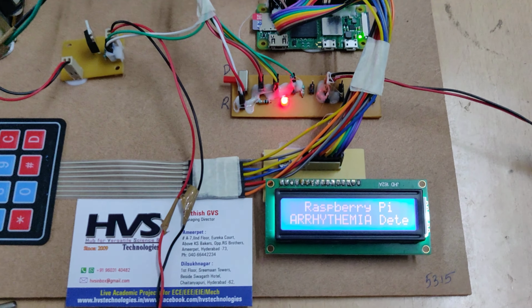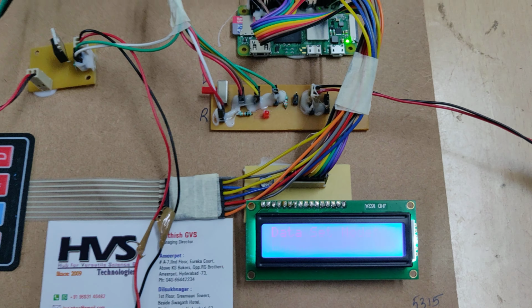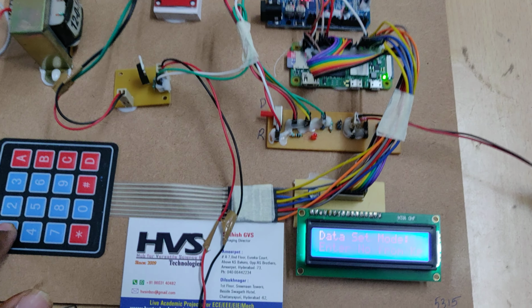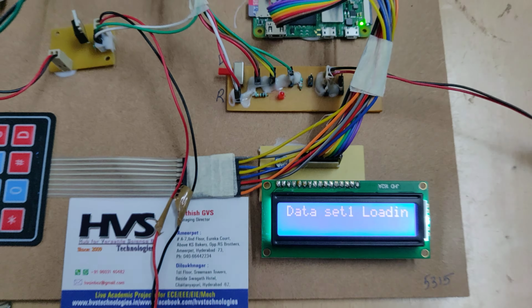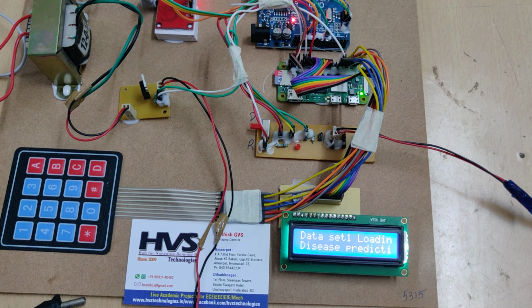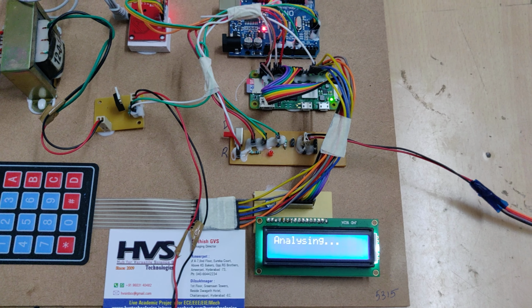Once the booting was successfully done, we got the welcome message, and after that it will show it is in dataset mode. So let us enter dataset 1. Dataset 1 is loading. It will take around 5 to 6 seconds based on the dataset memory, and then it will analyze that.